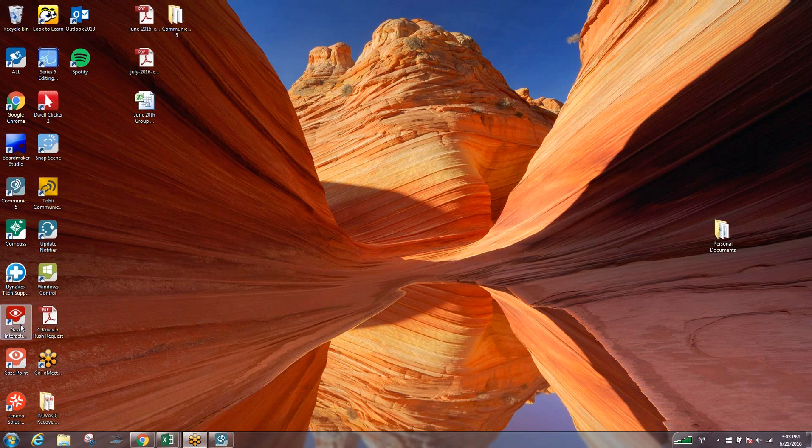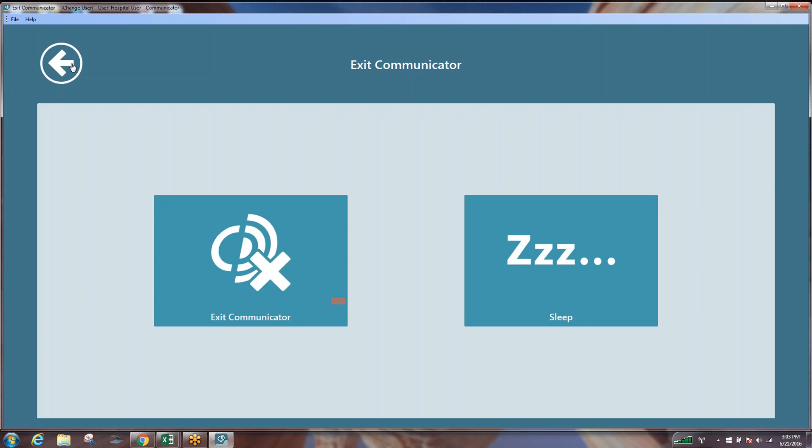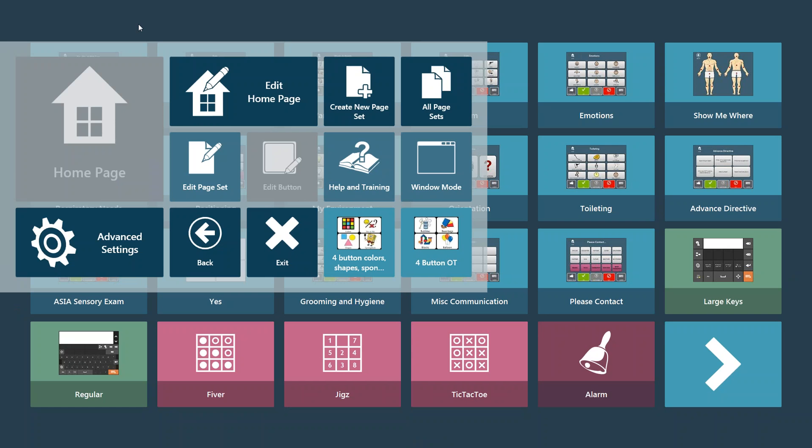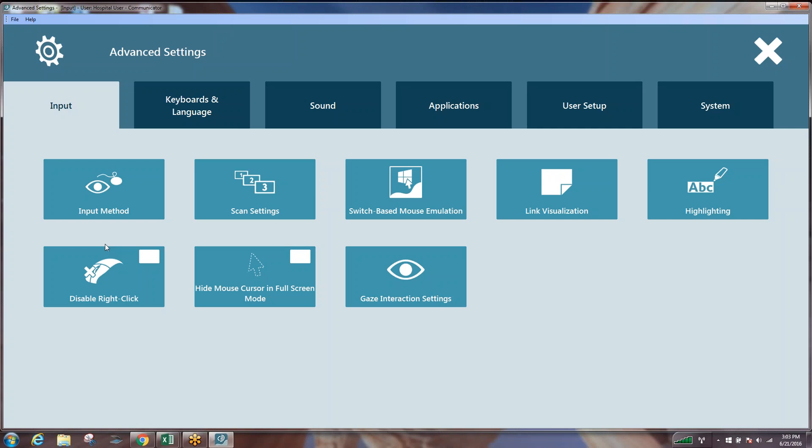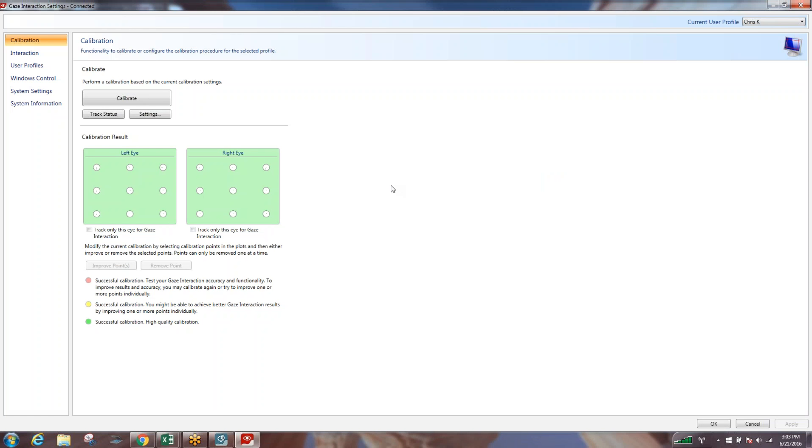Like with many things in Communicator you can access this settings menu two different ways. You can come out to the desktop and double click that to open it, or you can go through within your Communicator 5 software. You can right click if you're on a computer or you can hit the third button on the left hand side of the i-series device, the one with three dots on it, to bring up your quick menu guide. Then we can go into our advanced settings and we can go into our input method and it's going to allow us to go into our gaze interaction settings from here. This will bring us to this same screen no matter which way you do it.